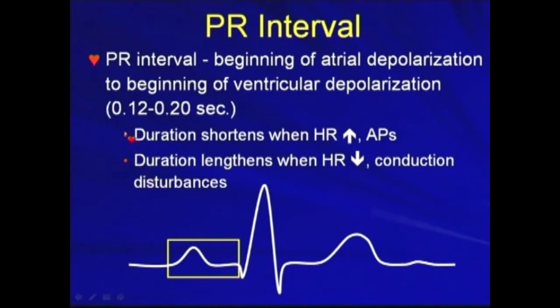It is usually 0.12 to 0.2 seconds. The duration may be shortened when heart rate increases or when there's presence of accessory pathway. And the duration will lengthen when heart rate decreases or there's conduction disturbances.